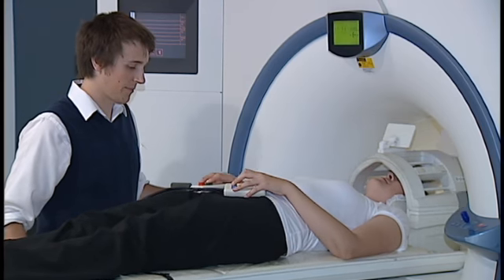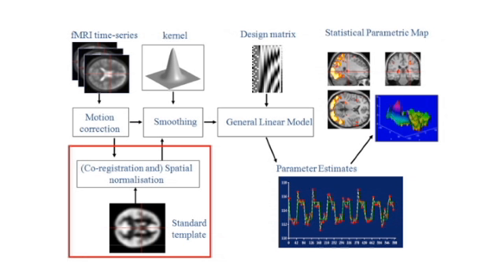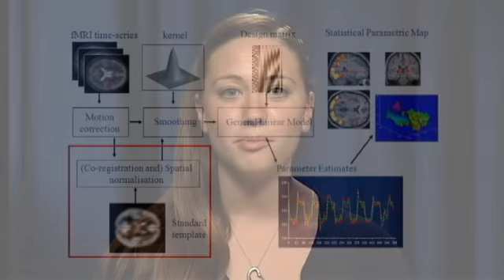Once we have collected all of the data from the fMRI scanner, we can begin the analysis. Analysis of brain imaging data involves numerous steps, including corrections for movement and transforming the data into a standard atlas data space. We have developed scripts that automate analyses of large groups of participants. Our data processing stream also involves a number of quality checks.